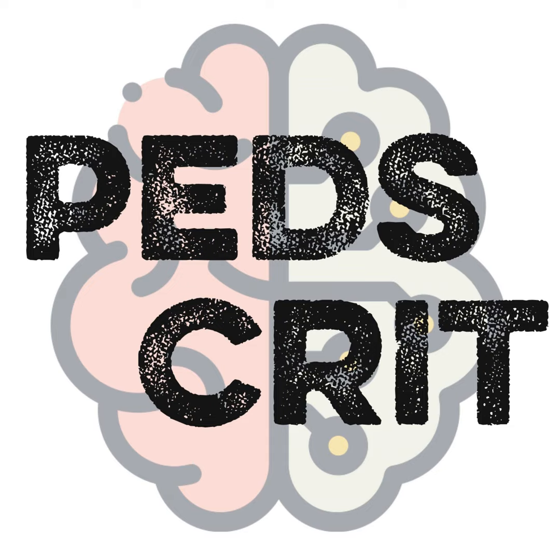In pediatrics, we have a couple of different ways of setting PEEP. I set PEEP in one of 2 ways, depending on how hemodynamically stable they are and how recruitable I think their disease process is. In most patients, I do what's called an escalating PEEP trial, where I set the tidal volume at approximately 7 per kilo. Okay, but anywhere less than 8-ish or less is acceptable to me, as long as my peak pressures in decelerating flow stay less than 30 to 35.